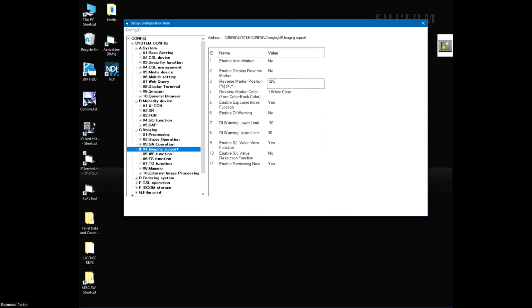Generally speaking, the technologist that pays attention, it will cause them an annoyance, because if they are only one S number off, so the range was 400 to 600, we'll say, or 400 to 800, and this S number was 399, they will be prompted with a warning message when completing the study that they should review the image.